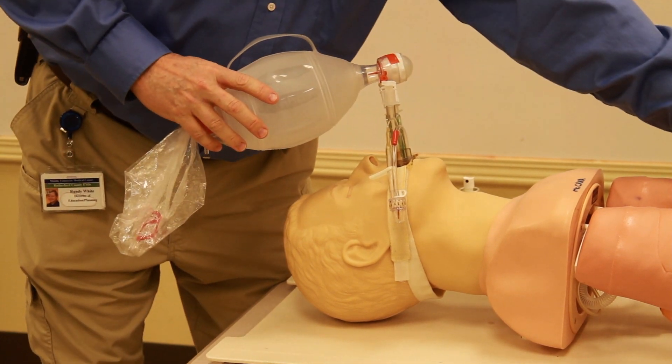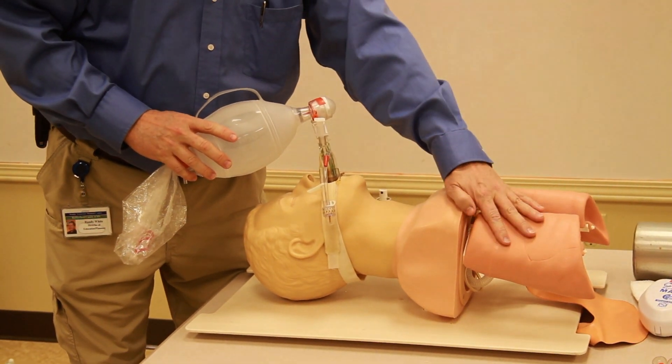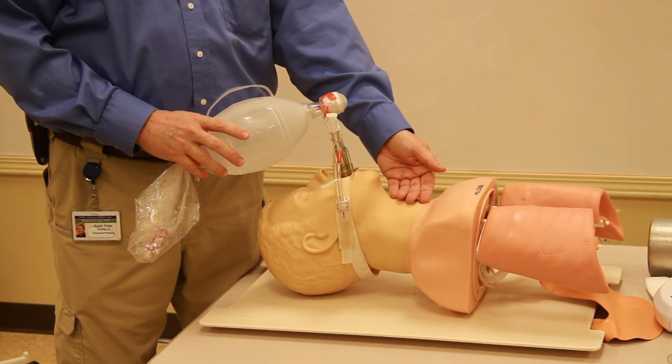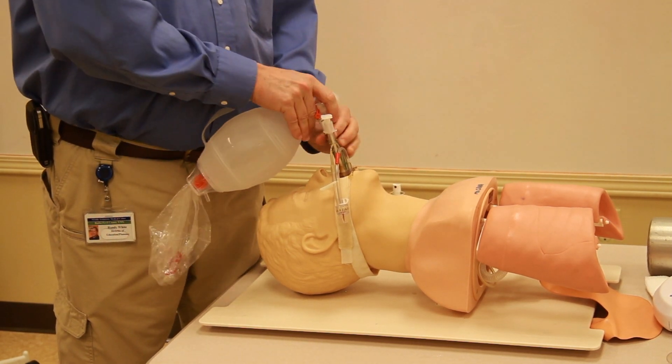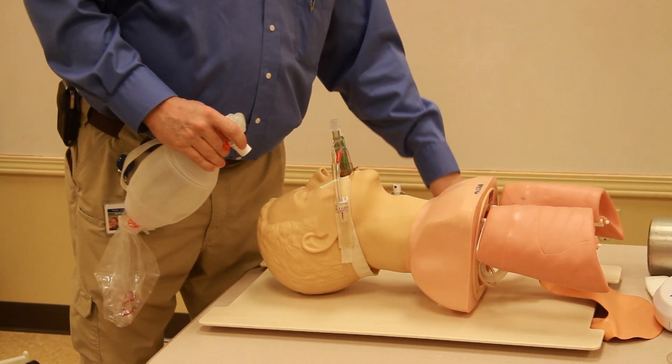Now I ventilate through the colored tube. I listen for stomach sounds and then listen for lung sounds. If I have lung sounds, the distal end of this tube is in the esophagus — where it should be.